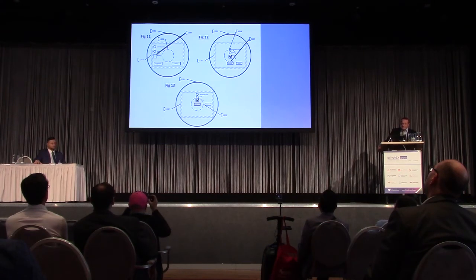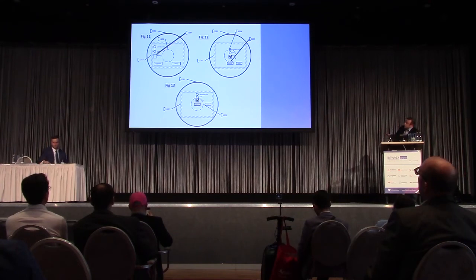The system detects attempted accommodation, again by tracking focus and by tracking vector changes in the gaze. The disposition of the image gets recomputed so that the checkbox, which is of interest to the user, comes in focus at 1203 in figure 12, and due to the fact that the user has selected that particular UI component and focused on it, the UI component gets selected.